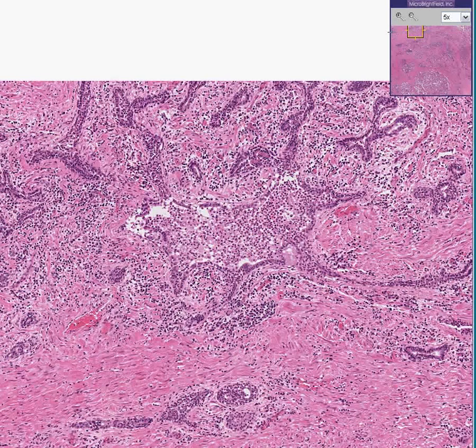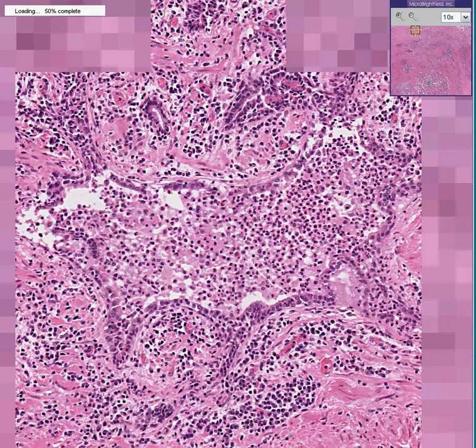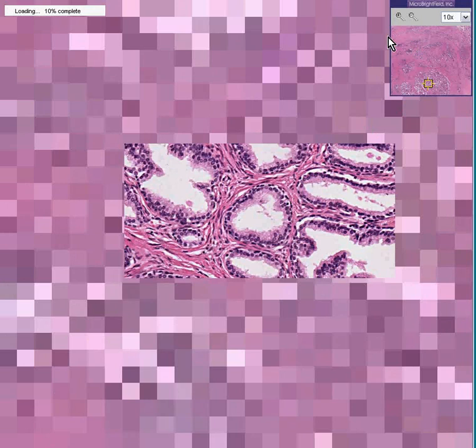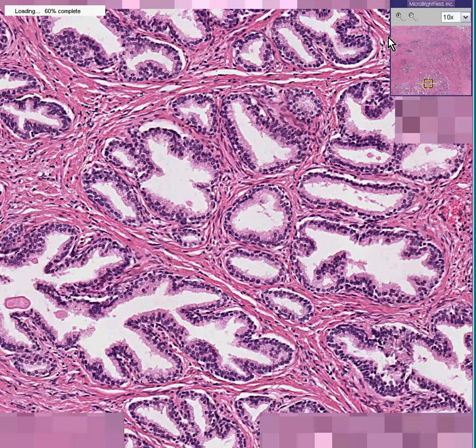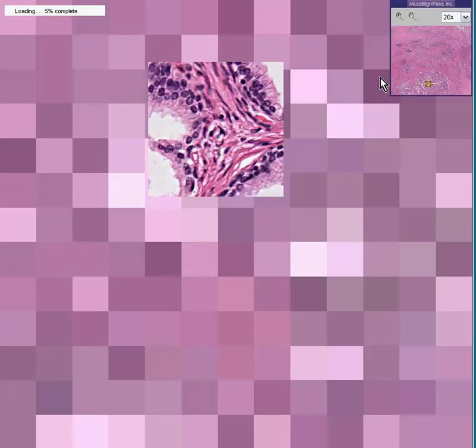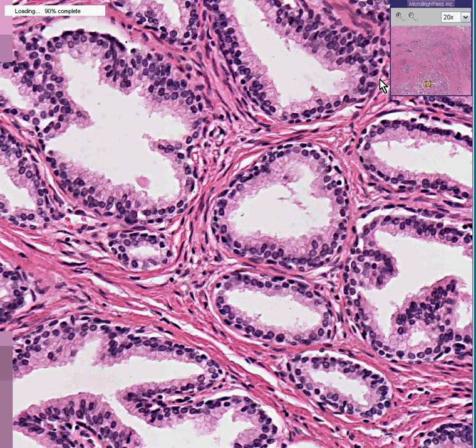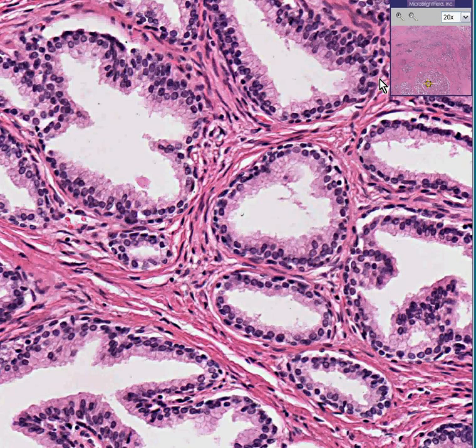If you wanted to spend hours looking at all these normal glands to see if any of them were growing haphazardly, proliferating abnormally, or had prominent nucleoli to look for atypia or cancer, you could do that — be my guest. But I can already tell you without examining this gland very much: you're not worried about a neoplasm altering this normal histology. You are concerned chiefly with the inflammatory components.